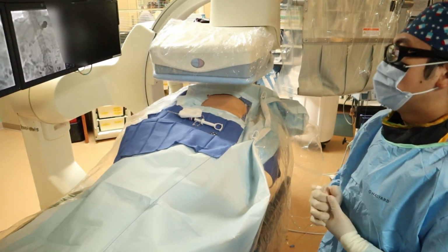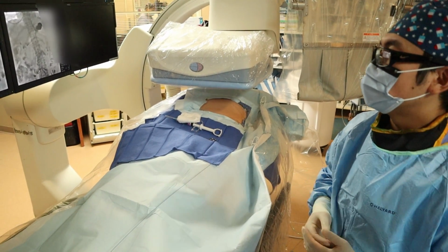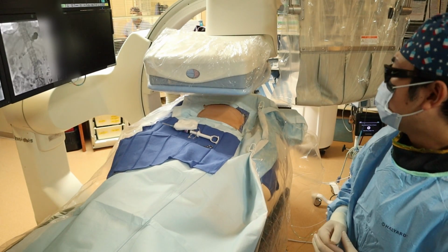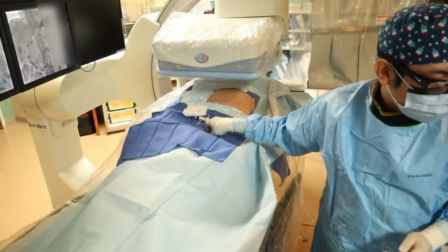It's getting distended nicely. We want at least 500 cc of air in the stomach. The more the better, as long as the patient can tolerate insufflation without getting nausea. Sometimes they can get really nauseous if you distend the stomach too quickly, and they'll throw up and it'll become a huge issue on the table. So it's getting really well distended now.